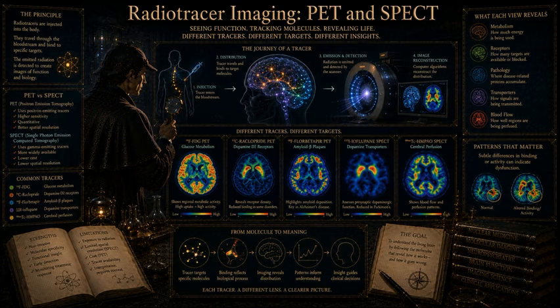radiation. To counteract this, a mathematical spatial filter, usually a ramp filter, is applied to the raw data before it is back projected. This filter essentially sharpens the edges and suppresses the blurring halo, allowing a much clearer image to emerge. The major advantage of filtered back projection being that it is computationally very fast. It's a straightforward mathematical operation. It is extremely fast, which was crucial in the early days of computing.